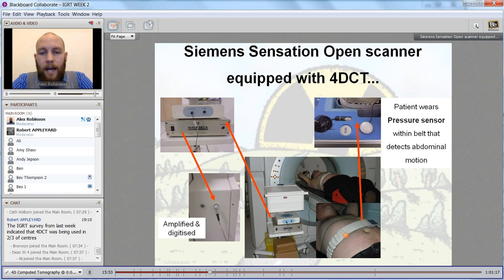Now we have to consider that, to get the most accurate dosimetry, this will create some form of artifact. So ideally, we do not want this on our lung volume. The other thing you have to consider is that if I put this directly onto where my tumour happened to be, then I'm going to get variation in axial slice separation due to this belt. So we do have to consider its location. This is connected to this box over here, which is the computer software, which is then connected to our CT scanner as well. So that's the setup.